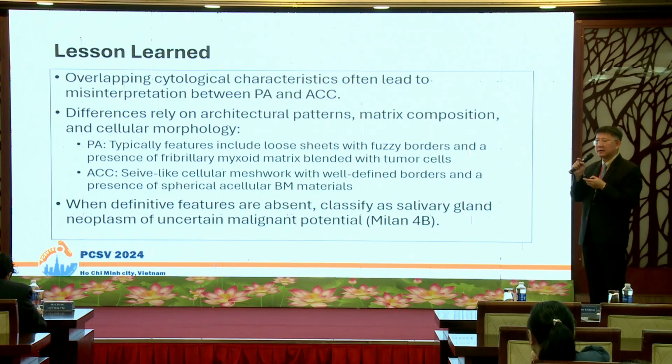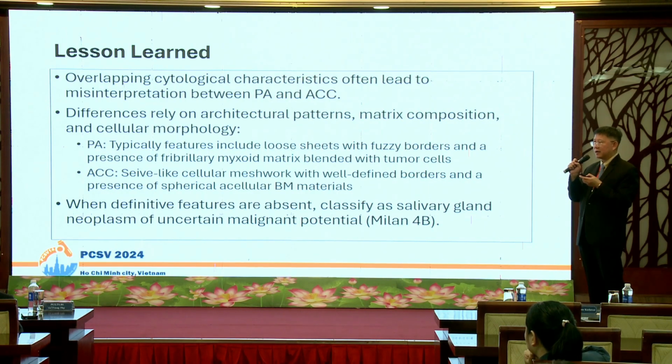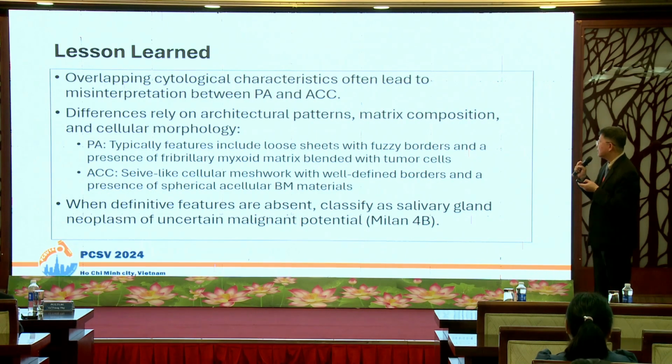So the lesson learned for this case: you must not jump to a conclusion when you don't see the full criteria. Because in this case, I did not see the myxoid matrix, I should not have made a diagnosis of pleomorphic adenoma. Just be careful that adenoid cystic carcinoma can sometimes mimic pleomorphic adenoma.